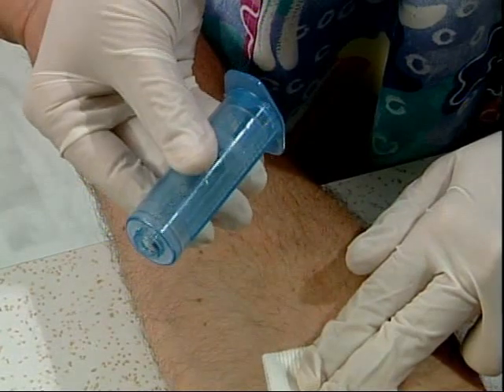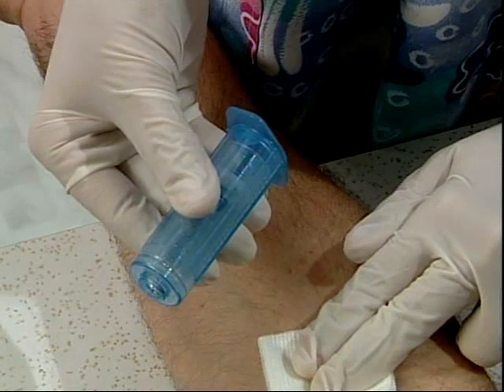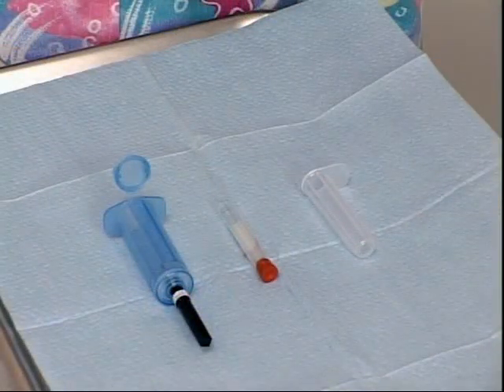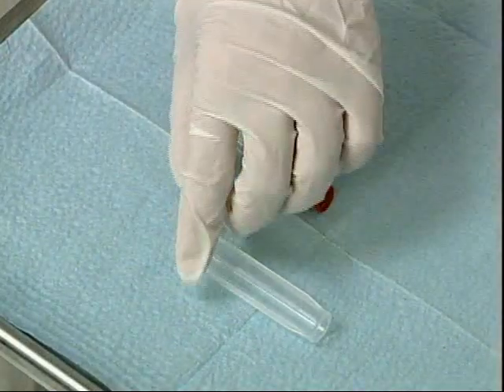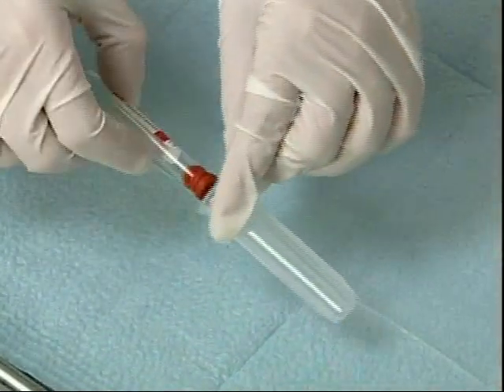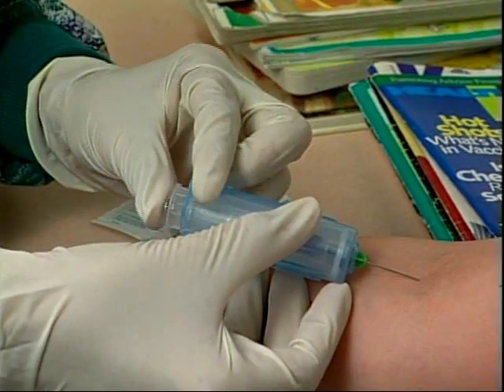VanishPoint tube holders completely enclose the contaminated needle and prevent needle removal, which is prohibited by OSHA. When using small diameter blood collection tubes, you should use the VanishPoint tube adapter. Begin by inserting the tube into the adapter, then insert the adapter into the tube holder. Repeat if necessary. When the last tube has been filled, remove the adapter and close the end cap.